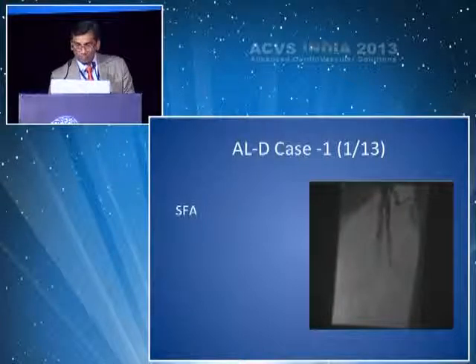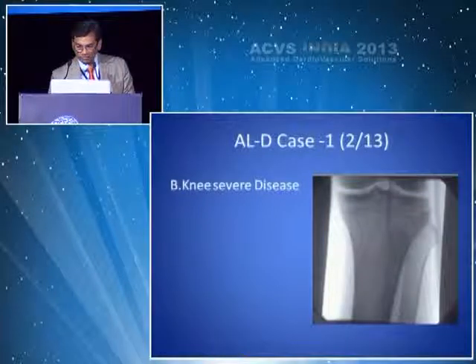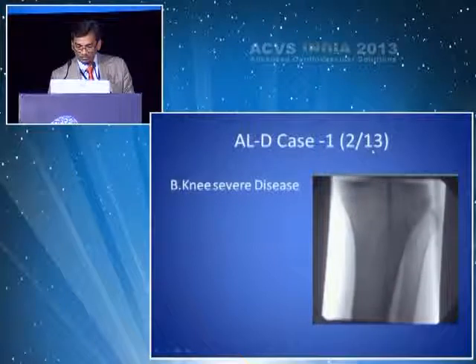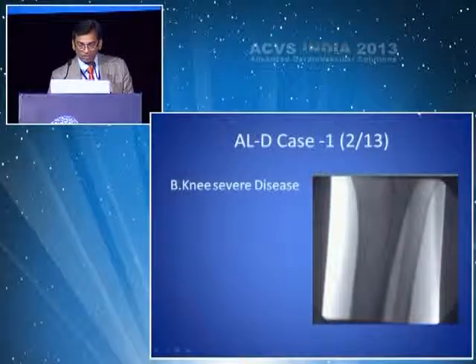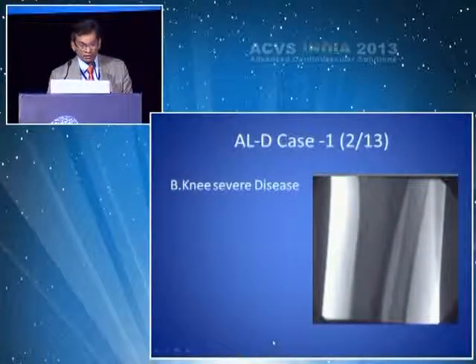There's a little bit of a delay in video clips. As you can see, infrapopliteal hardly anything, and there's one single tibioperoneal runoff which hooks into a collateral vessel.